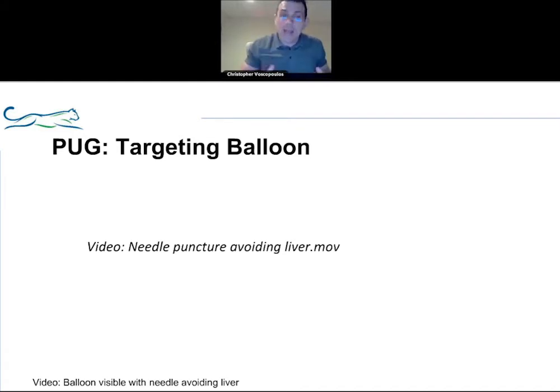But when you're ultrasound guided, you could remanipulate the balloon placement, get the liver out of the way, and go for puncture. The main point here is that this is a direct visual guided technique. And so if there is something in the way, you could either A, readjust to provide for a safe procedure, or B, abort if there's no way to adjust.